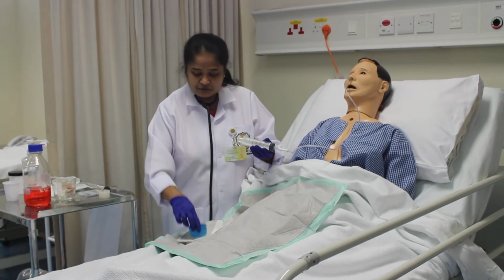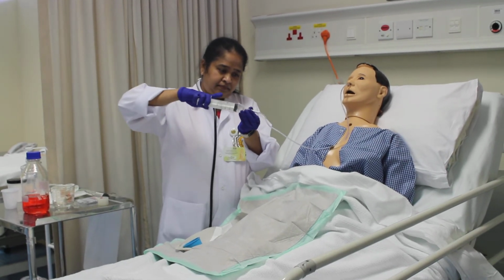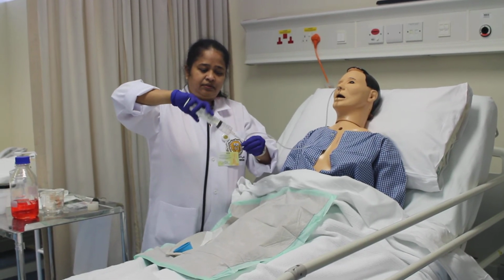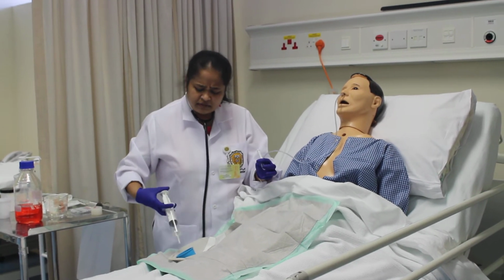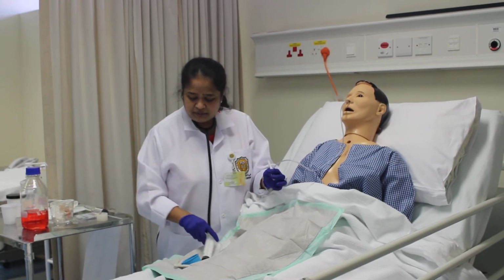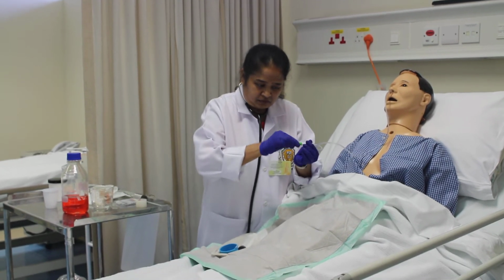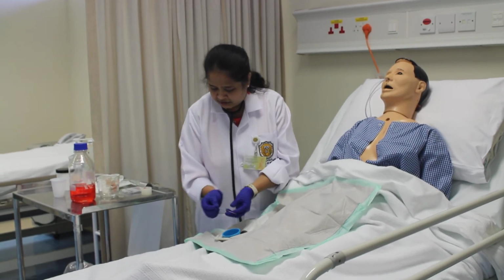I am going to withdraw some amount of gastric juice. Sometimes when we do it for the first time, we may not get any gastric juice. If you are taking a very little amount, just 2 to 3 ml will be enough. You pour it over the pH strip. Close it. Now I am checking the pH.